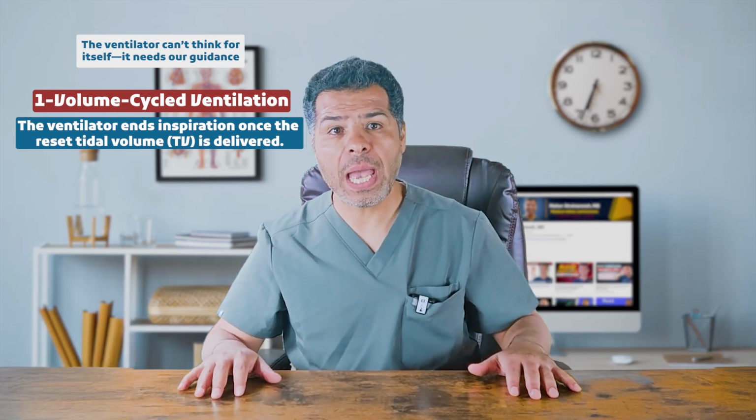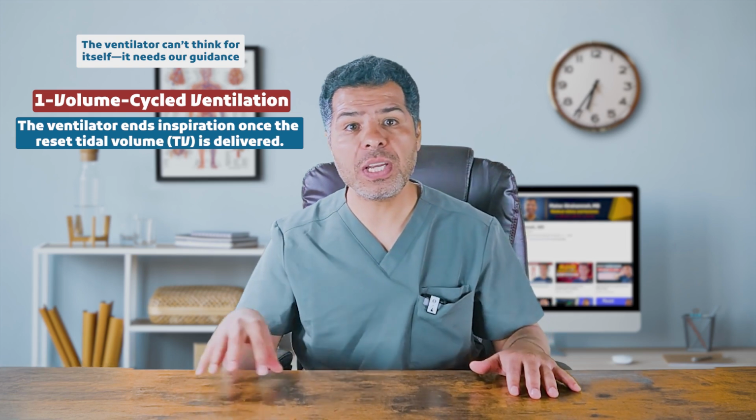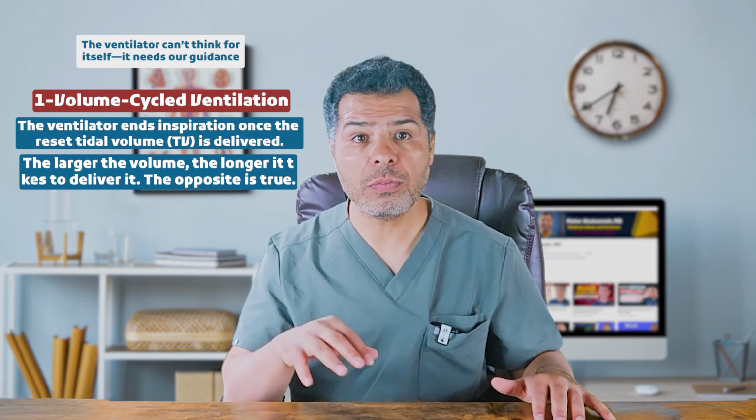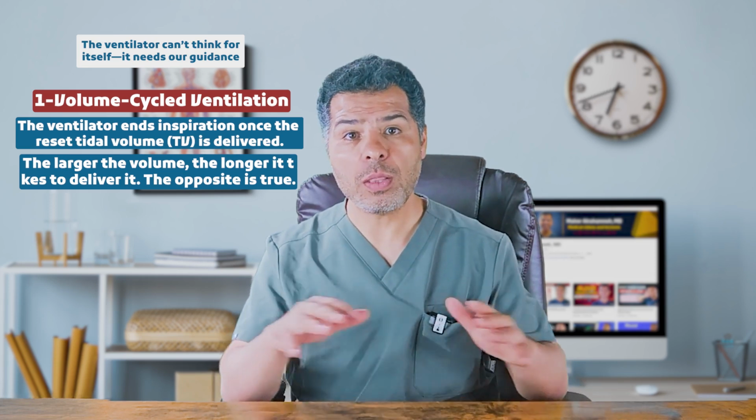What do you think will happen to the inspiratory time if we increase the tidal volume here? Of course, it will increase. The larger the tidal volume, the longer it takes to deliver it, and the opposite is true.